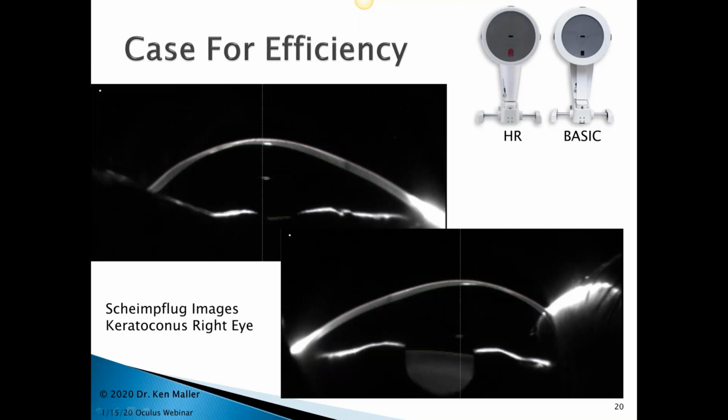Now let's move on a little bit here. This is that keratoconus cornea, and you certainly can see how the visual axis has been moved, how it's much, much more curved down up over here.